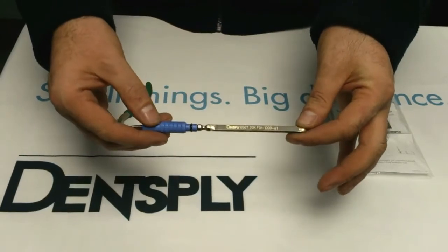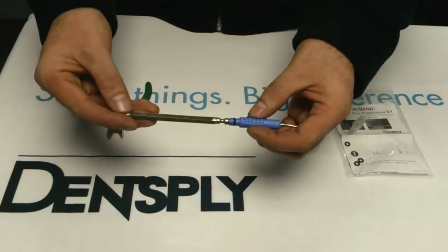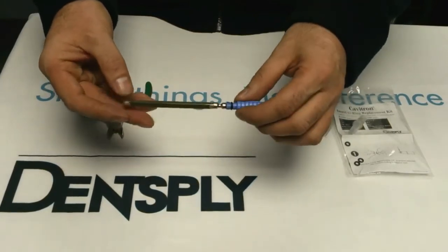This is a Cavitron FSI 1000 insert and it has a black sealing o-ring which: one, holds the insert in the handpiece; and two, provides a watertight seal.